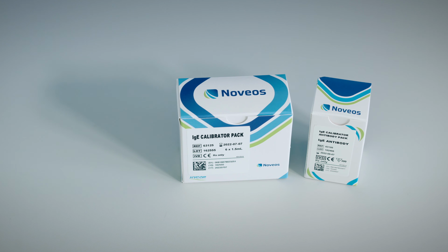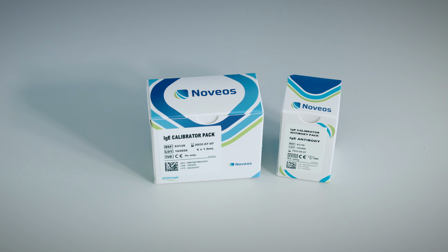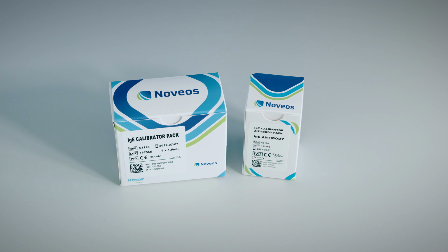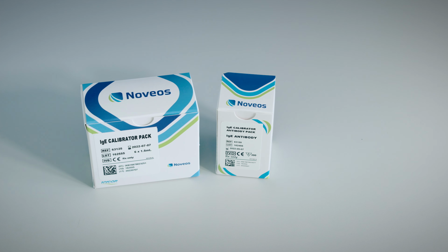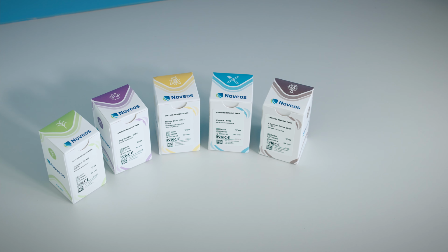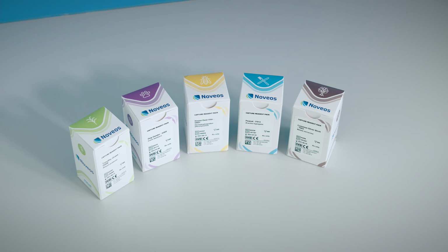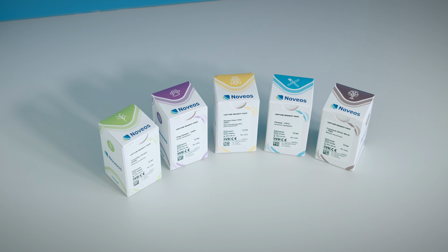Here we have the calibrator pack. 6 calibrators are included in the concentration of 0.07 to 100 kU per liter. To create a calibration curve, you also need the calibrator antibody pack as the corresponding capture reagent. Lastly, we see here the allergens, also known as capture reagents, for the detection of specific IgE. These are color-coded according to the allergen subgroup.